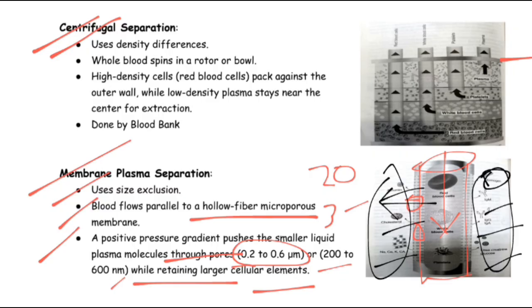So this is the main process, plasma separation by membrane.